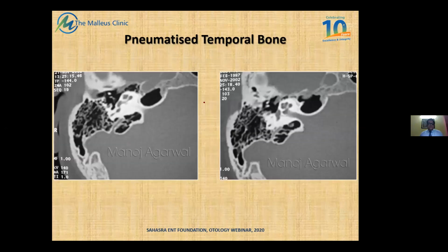Same patient, okay? This is another pneumatized bone, and this is a magnified view to give you an idea about the petrous apex. Just remember the previous axial scans from the last week's lecture. It was iso-intense. It was of the same intensity as the brain because it had marrow. But now it has one solid piece of air cell. And such an air cell is very, very liable to either developing effusions or even a cholesterol granuloma. Anyway, we'll talk all about all of that later on. But this is a case of a singular apical air cell in the petrous apex.